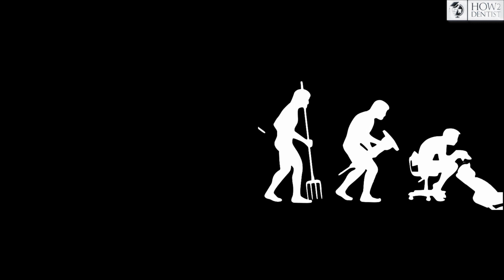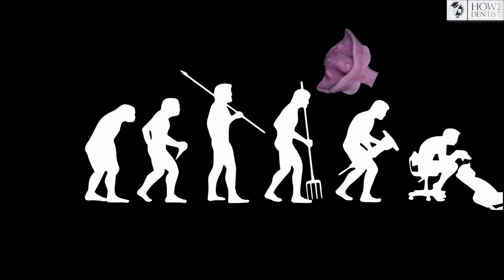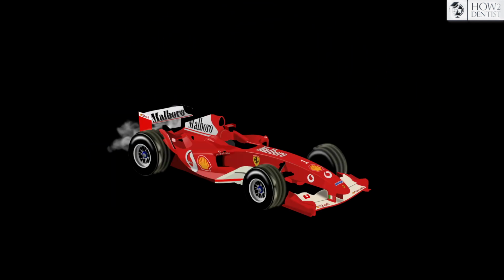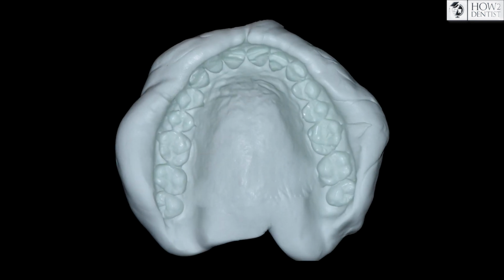The manufacture of a custom tray is usually delegated to young technicians who stand at the very beginning of the production chain and do not have a lot of ideas about what and why to do. So let's start. The custom tray begins with the primary impression. Therefore, the palate, transitory fold and retromolar region must be visualized on it.